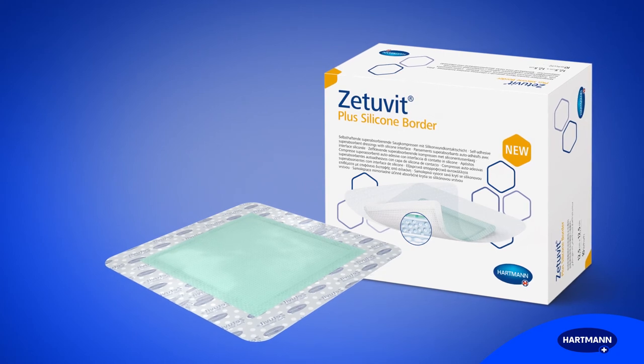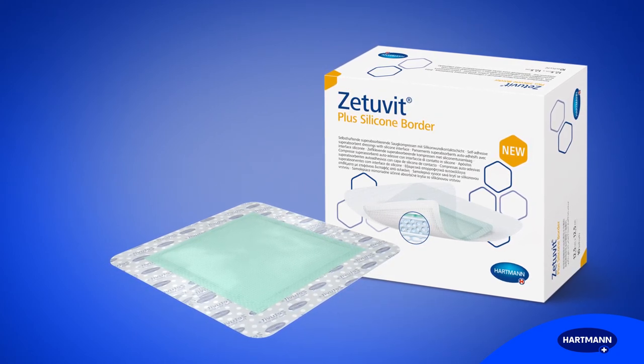For optimal moisture management, make Zetuvit Plus Silicone Border your preferred choice.